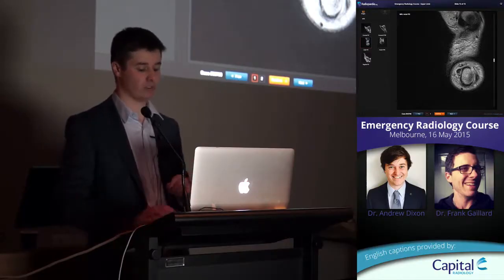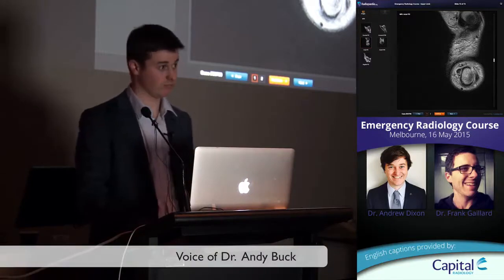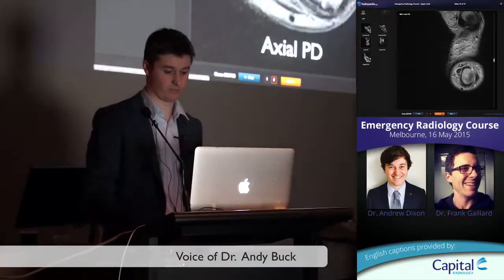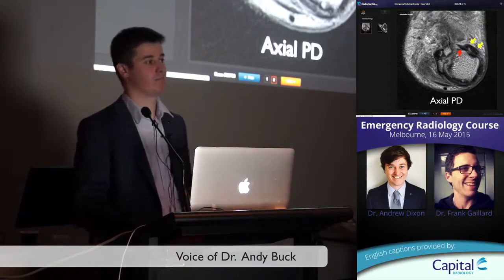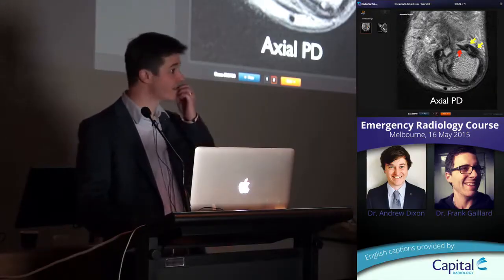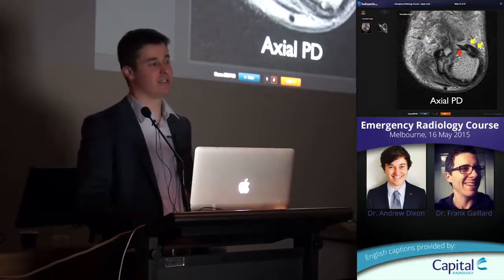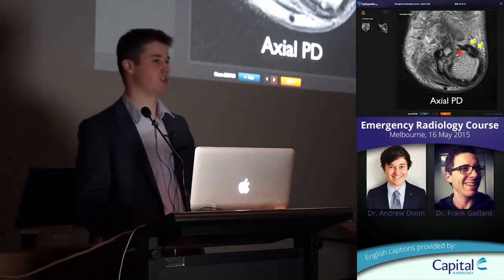Can I just reiterate that point, because I think in the old textbooks they used to say you can do stress views, but you can't do stress views on the first day anyway because they're too painful. I still see people getting sent around to radiology asking for stress views on the day of the injury, which is mad because it's just painful. And I think some of the old textbooks used to say, oh, inject some local and then send them around for stress views, and I think that's just a double. I think the injury is so significant that it doesn't matter what your stress views show, you're going to do an ultrasound or an MRI to confirm that it's there or it isn't.